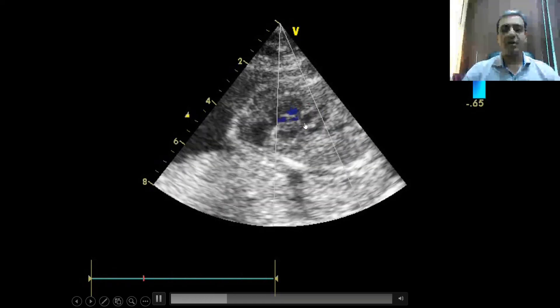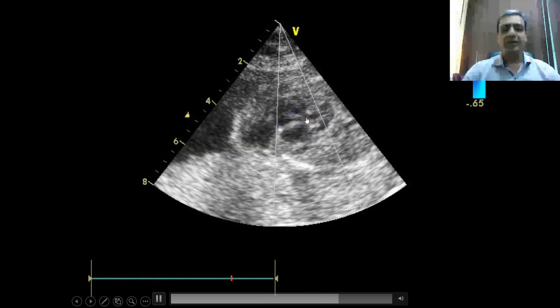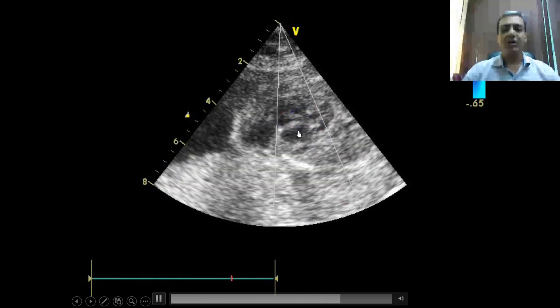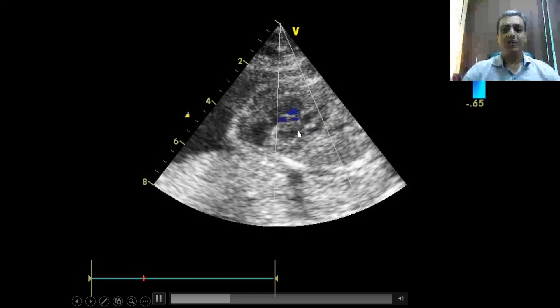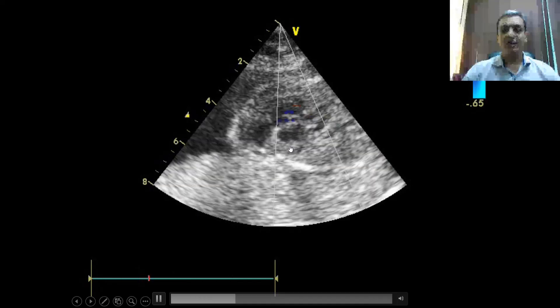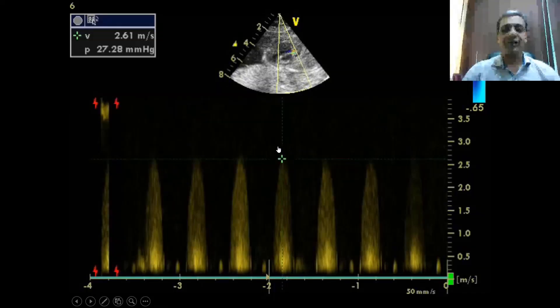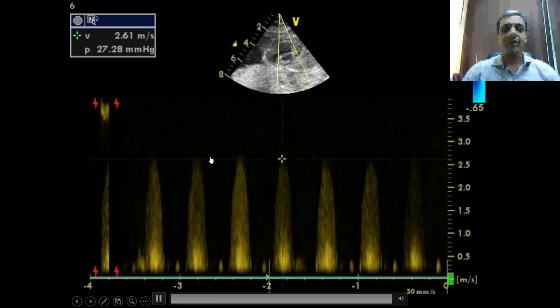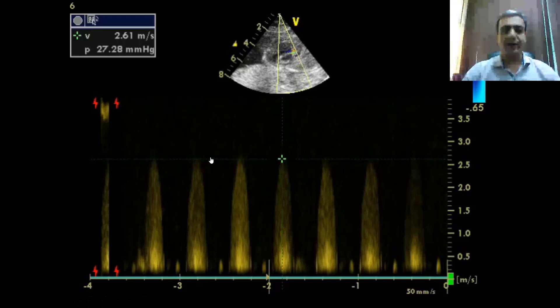There is flow acceleration across the aortic valve; any flow acceleration across the aortic valve is suggestive of aortic stenosis. In this case, aortic stenosis was the main dominant feature that led to hypoplastic left heart. The gradient across the aortic valve was 27 mmHg at a gestational age of 20-25 weeks — this is very high and should be considered as severe aortic stenosis, and it will definitely progress into hypoplastic left heart.